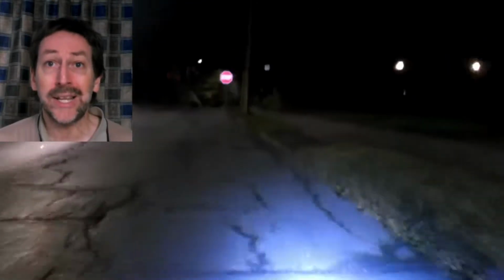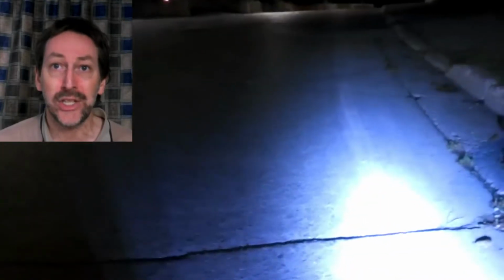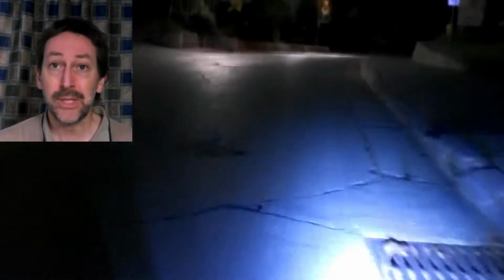Adding this white LED is for my benefit. I put it there so that I can see what I'm driving over next. I'm not wanting to drive over water, snow, ice, dead animals, sewer drains, limbs from trees, and the occasional nail or screw from construction sites. So I aimed the light down about a second or a second and a half past where I'm going to be driving over next.